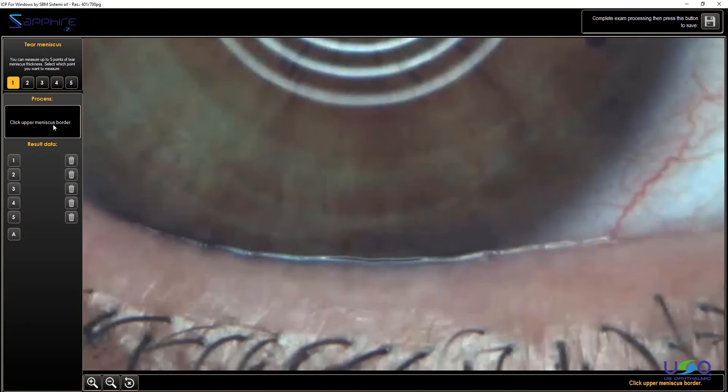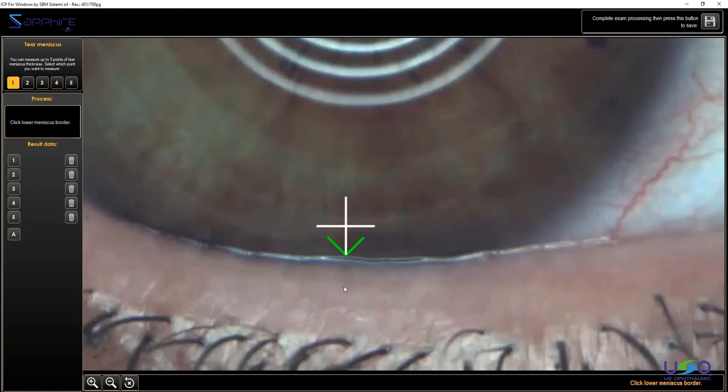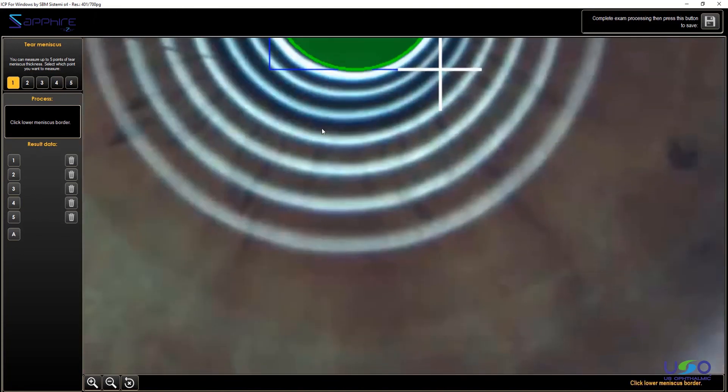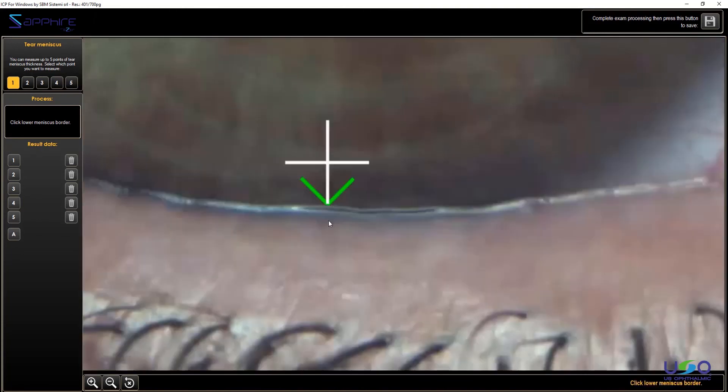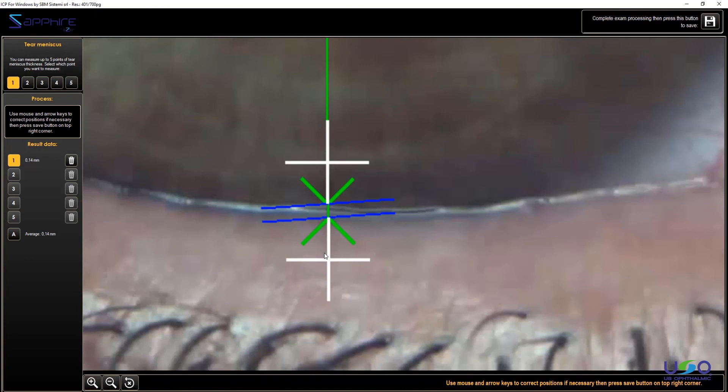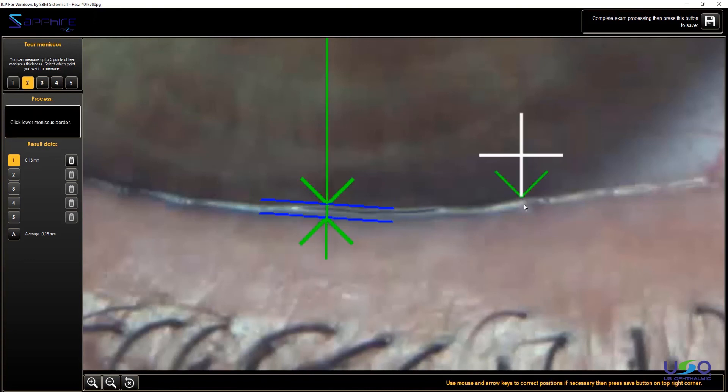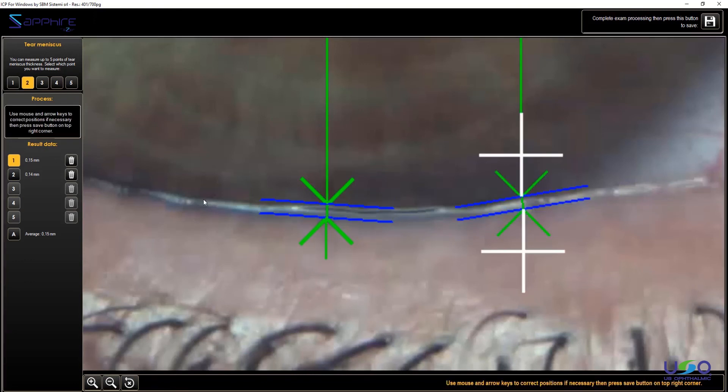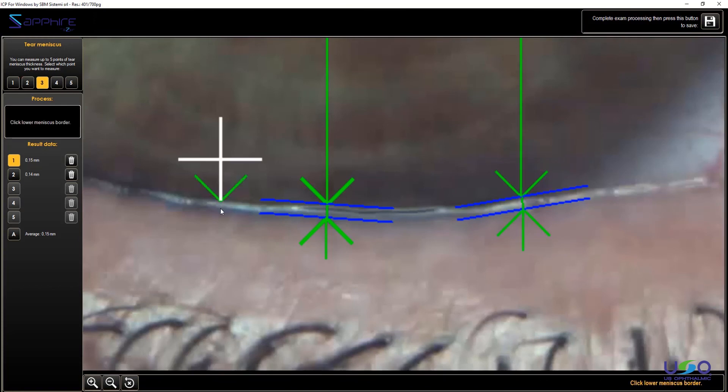Click upper meniscus border. For upper border, we mean the border of the tear meniscus, so not the eyelid, but the white edge over here. You can even zoom more if you care. Now it's much better, it's much more easy to do that. So from the white edge to the eyelid, like this, you can set one more from here to here, from here to there.